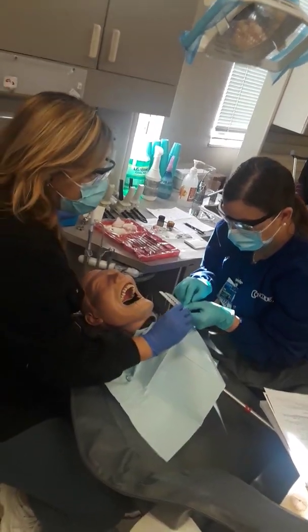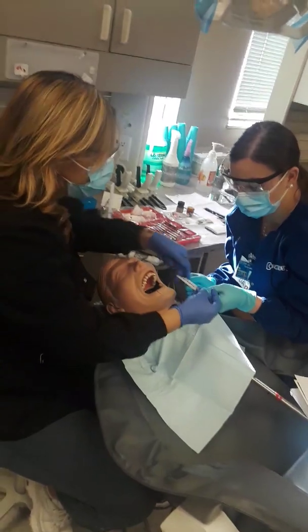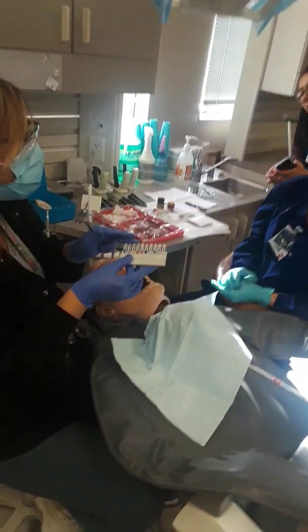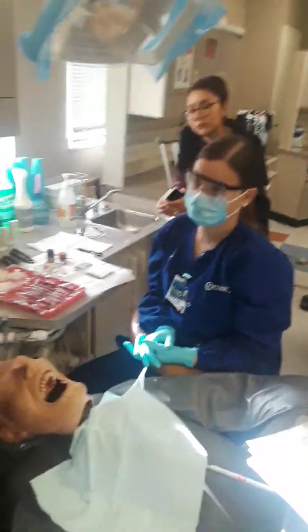Always take your shade guide tab out. You want to take it out because if you do this, I'll show you real quick. If you do this, your eyes will coincide with all the colors and you're not going to be precise. Just like a shade guide, just going like this.